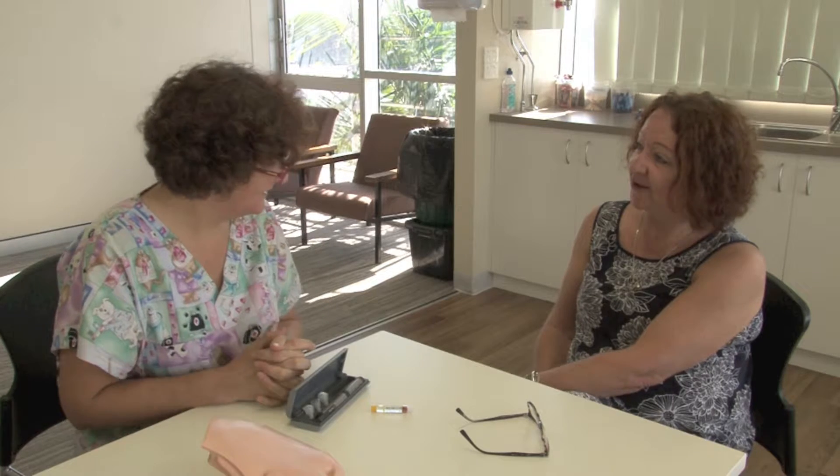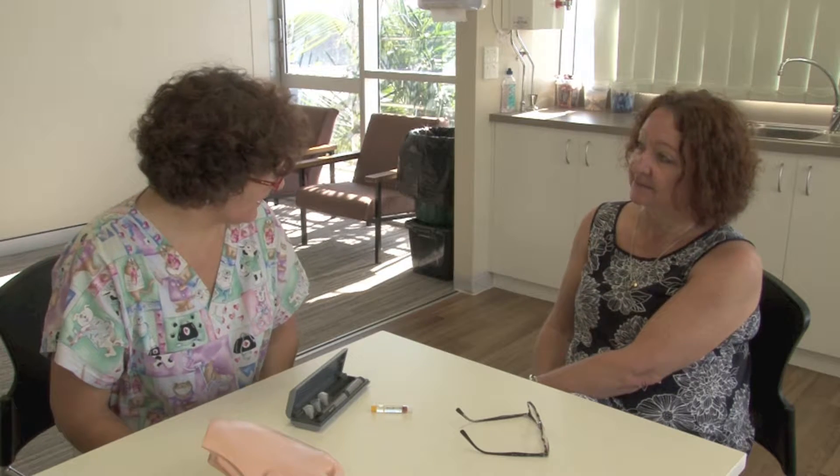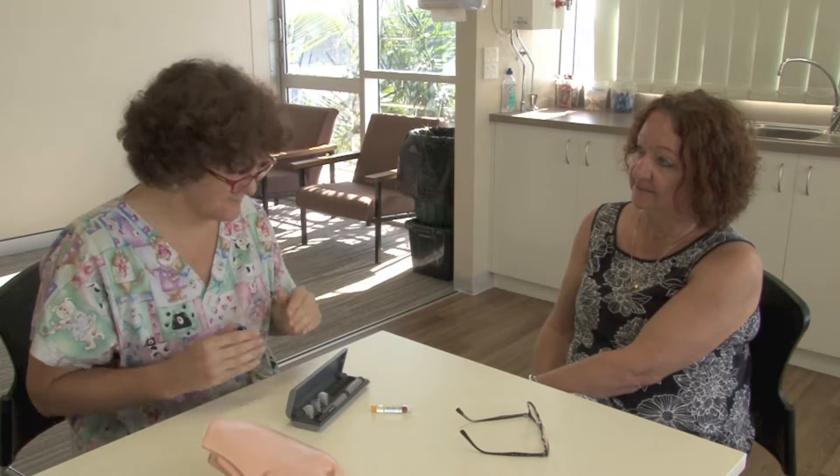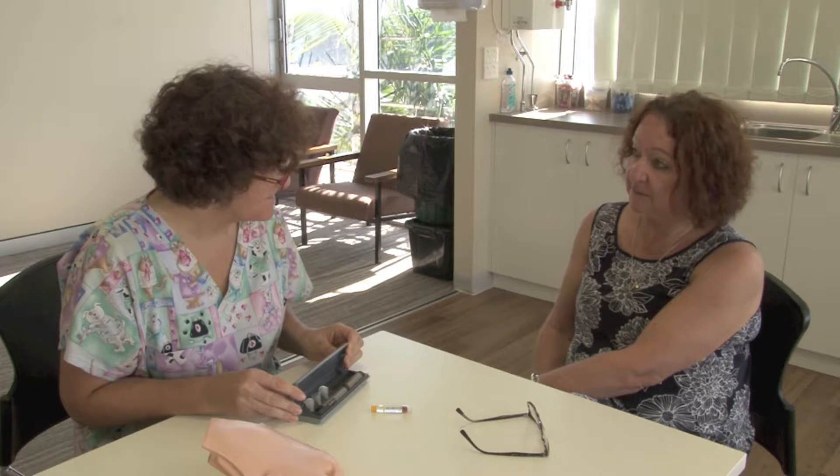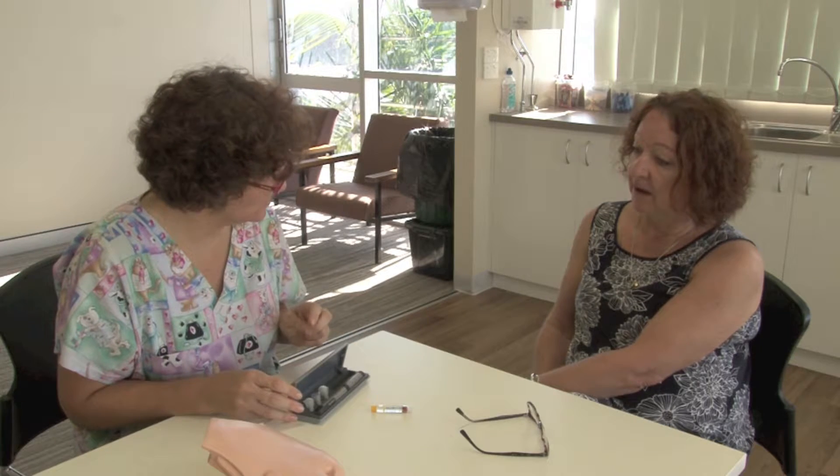Hi Sandy, how are you? I'm well, thank you. How are you? I'm really good. Now, I'm the district nurse and they've asked me to come along and make sure that you're happy to use your pen. Would you like me to show you once more how to do that?